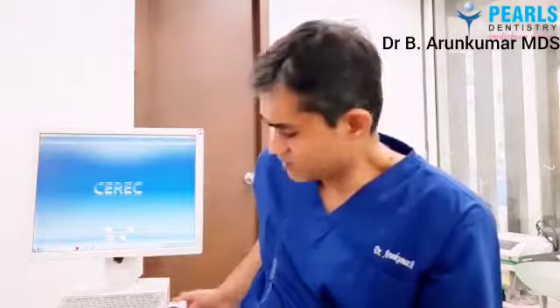Now in CEREC, we completely take that negative impression material out of the equation here. We don't take an impression at all. Instead of making an impression, the digital way is we capture the patient's teeth and the oral structures real time with a video camera. How it happens is we have something called the camera here. So this replaces the impression.